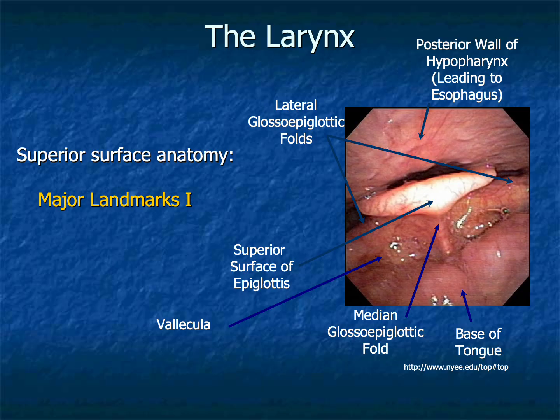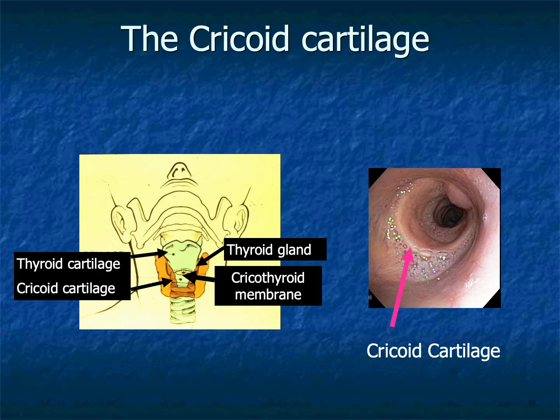These next slides review the major landmarks of laryngeal anatomy as seen during bronchoscopy. We identify the vallecula, the epiglottis, the piriform sinuses, the aryepiglottic folds, the true and false vocal cords, the ventricles, the arytenoid cartilages, and the cricoid ring. Initially, trainees might experience these structures as visually overwhelming. Everything appears pink, curved, mobile, and difficult to orient.